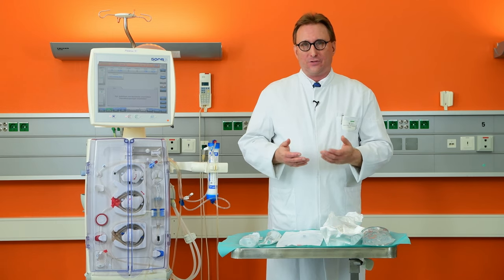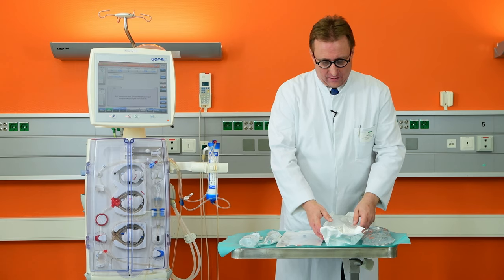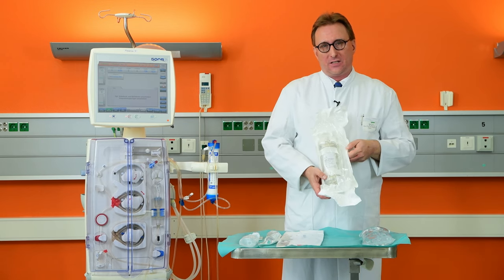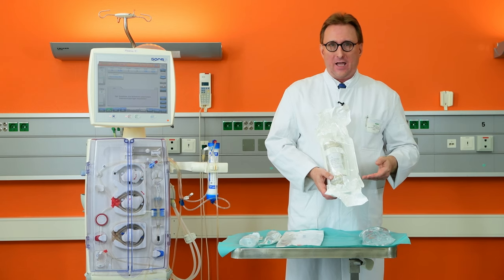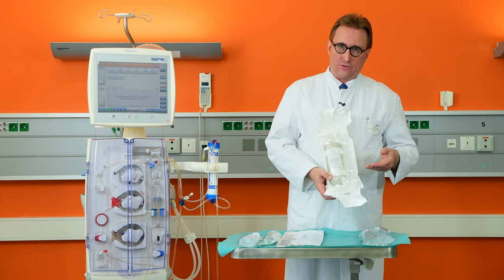Let's go first through the components you need for that. The core of the treatment is the Seraph blood affinity filter, which comes in a sterile wrapping and is determined for single use only.